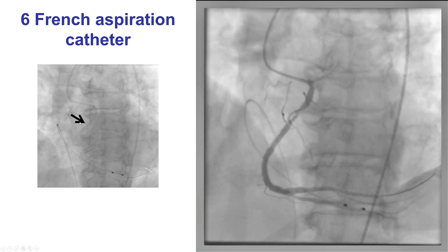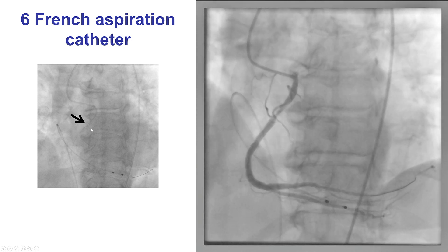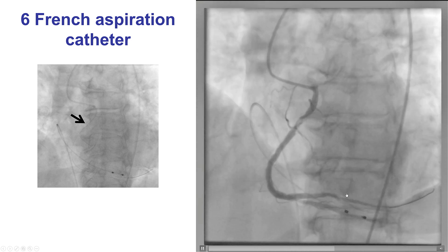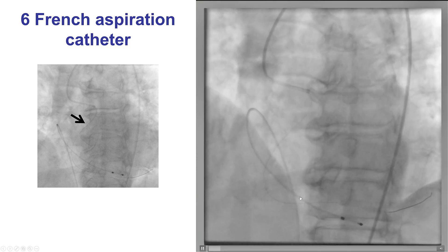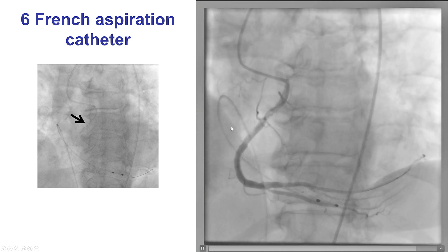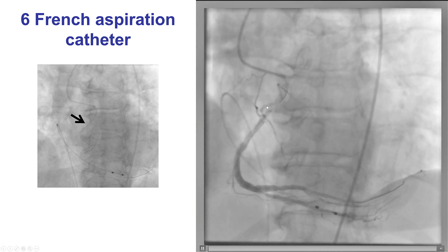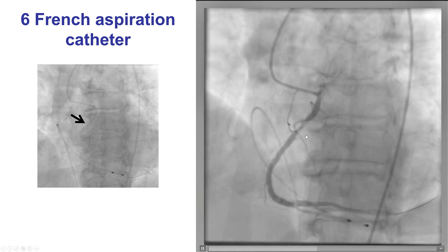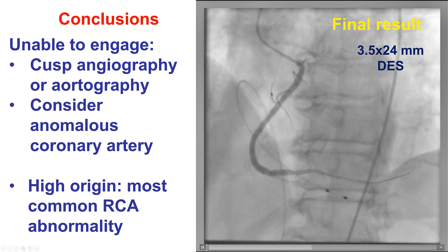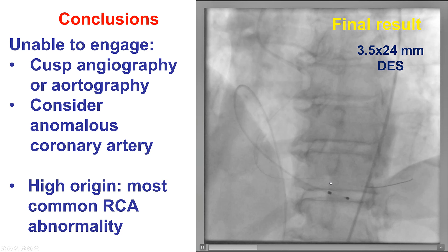There was a large amount of thrombus, which is why an aspiration catheter was used. We can see a temporary pacemaker — the patient did have bradycardia during the case that subsequently improved after re-canalization. After thrombectomy, we see much better the vessel. This is a large coronary artery that was successfully stented with a 3.5 drug-eluting stent, providing a nice final result.